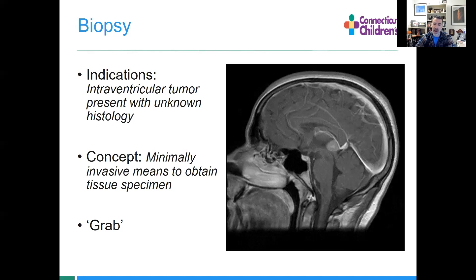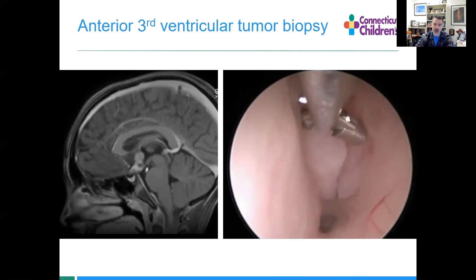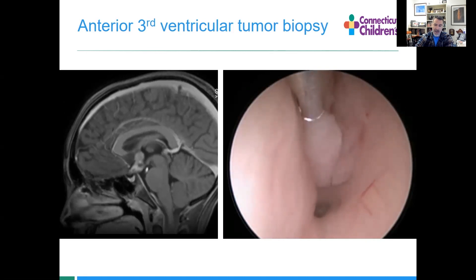There are circumstances where intraventricular tumor biopsy is needed — pineal tumors are classic for this. If you've got an intraventricular tumor, you want to know what it is to guide treatment, because there are circumstances where adjuvant therapy is a better way to go. We can do that in the anterior third ventricle. This is a suprasellar, ultimately germ cell tumor. You can see grabbing a piece of this in the third ventricle and bringing it out.